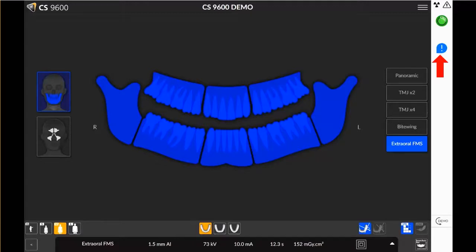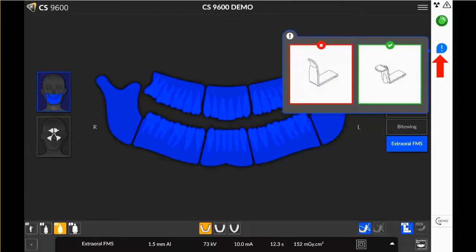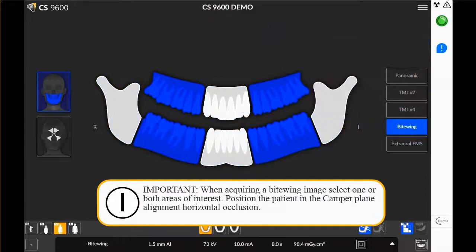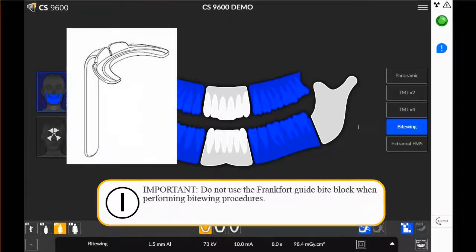Select the exclamation indicator to show the recommended accessory. The appropriate accessory will appear in green; the inappropriate accessory will appear in red. Important: when acquiring a ByteWing image, select one or both areas of interest. Position the patient in the Camper Plane Alignment Horizontal Occlusion. Do not use the Frankfurt Guide Bite Block when performing ByteWing procedures.